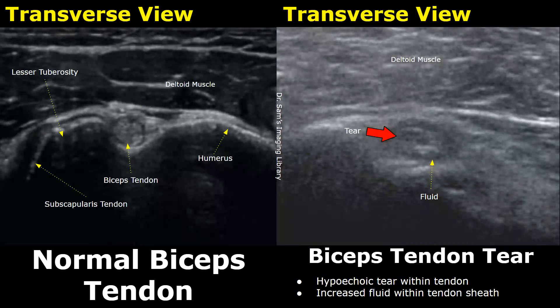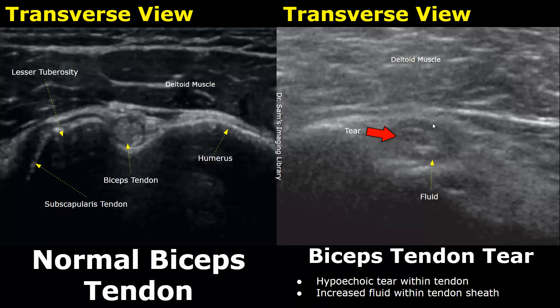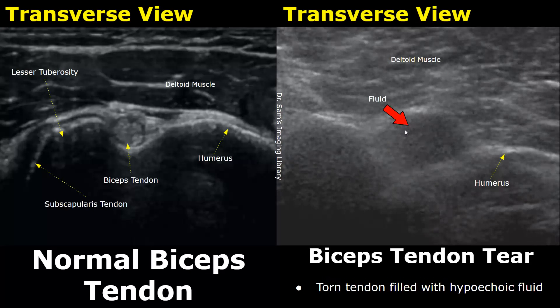Here is an image of a biceps tendon tear. It looks similar to tenosynovitis — we can find a hypoechoic tear within the tendon and also increased fluid within the tendon sheath. Here is another image of a biceps tendon tear where the torn tendon is completely filled with hypoechoic fluid, which may indicate a complete biceps tendon tear.